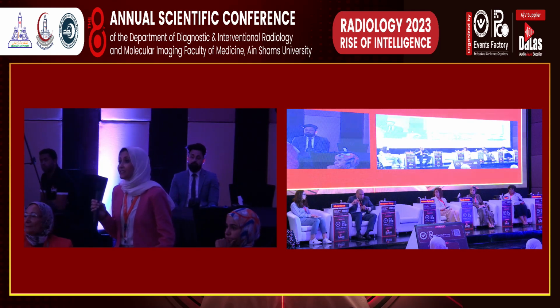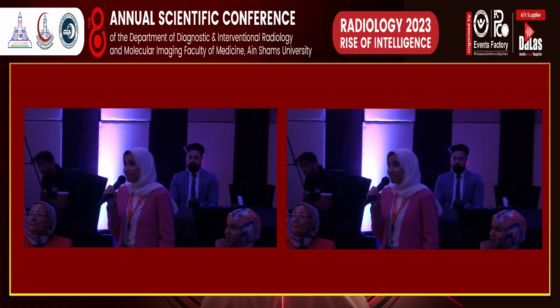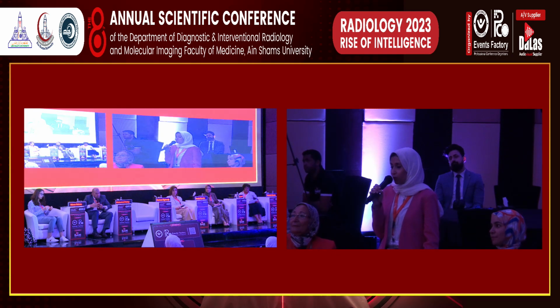بالمناسبه بحاله البلادر دي انا معجب بيها جدا لان انتوا مصورين عينه هو بلادر فول، مع ان ده مش البروتوكول بتاعنا ان احنا عين تو فويد قبل ما يعمل بات سي تي عشان البلادر ما تبقاش مليانه والداري مثلا لو في كانسر بروستات او حاجه. لا هي الحقيقه هي بس يعني احنا عندنا حالات كده، بس دي من الليترشر مش بتاعتنا في الوحده. تمام. لكن احنا عندنا البروتوكول بتاعنا، يورينري بلادر كانسر او البروستات ليه بروتوكول مختلف شويه.